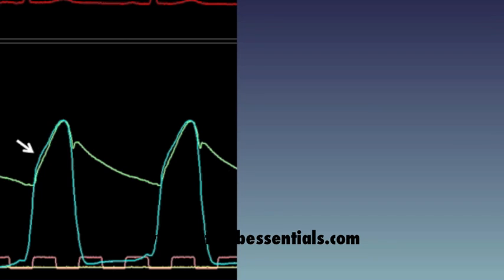The pressure continues until the T wave, at which time relaxation is signaled and pressure now starts to fall as the ventricle relaxes. You see the dicrotic notch and the fall of pressure back to the next systole. If we follow the LV pressure down to its minimum, that's the lowest pressure at the earliest point of diastole, and then across the diastolic filling period there is a gradual increase in pressure until the A wave, which follows the electrical P wave. The A wave is generated, and at the end of the A wave we start our cycle over again with isovolumetric contraction.